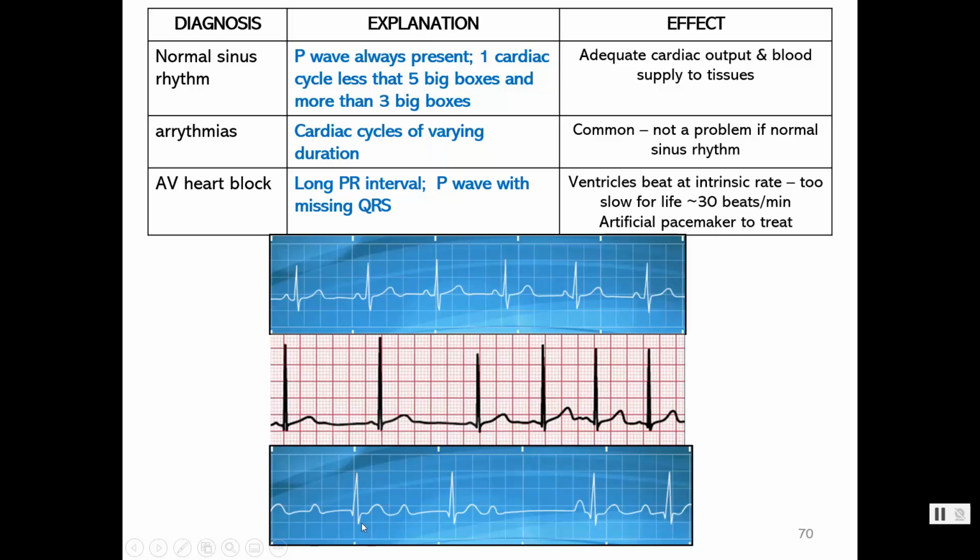Oh, and then we finally get depolarization of the ventricles. And then we get repolarization. And then we have our P wave. So the SA node fires, and then it pauses, blocked at the AV node. Okay, the ventricles got the signal, QRS complex, T wave, so we get ventricular contraction. And then look, we have a P wave. Nothing. It was blocked. That message got blocked at the AV node. It never made it to the ventricles. The SA node tries again. That one made it through.